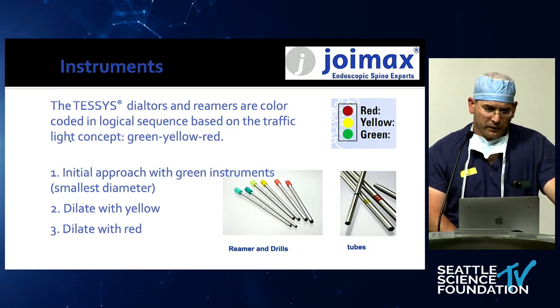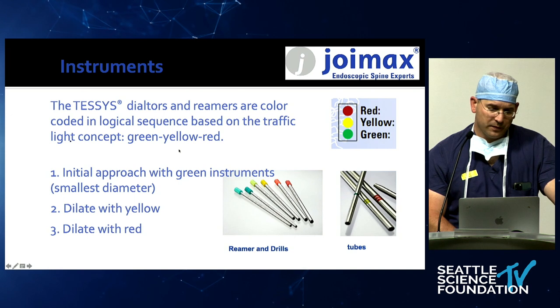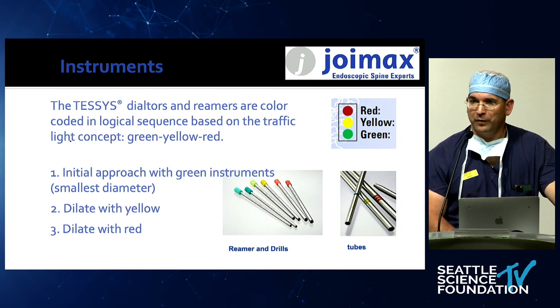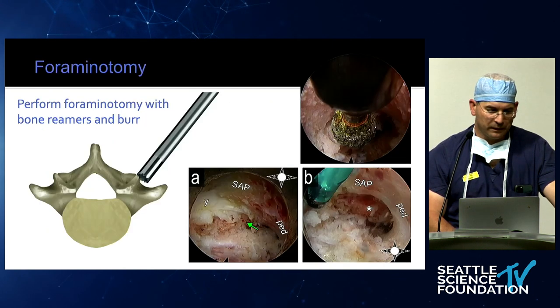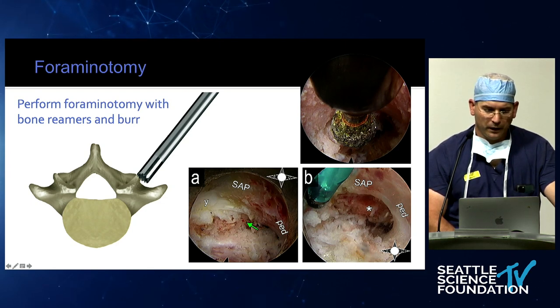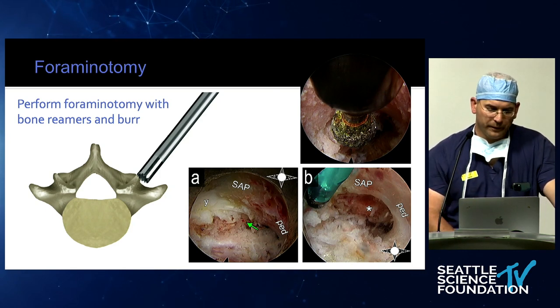Foraminotomy — some people call it foraminoplasty — is really important. We use reamers, which are disposable and always sharp. You dock on the SAP and ream. You can see the pedicle on the right side, the SAP, and you can use a drill. You expose a little bit of the ligament down at the traversing nerve root. You can make sure all the neural structures are both visualized and safe, and then under vision you can place a K-wire into the disc.